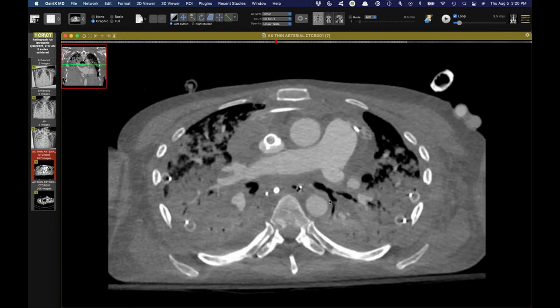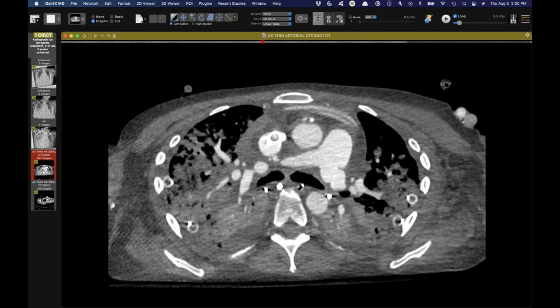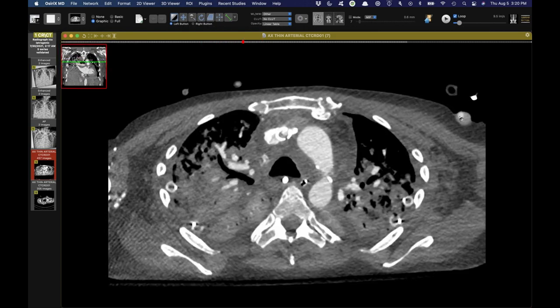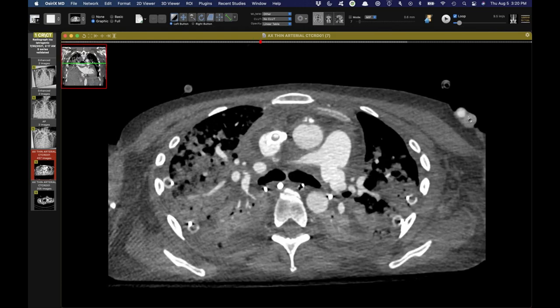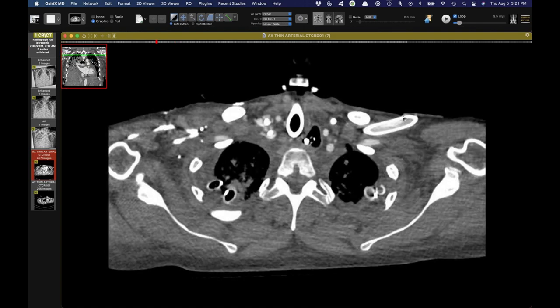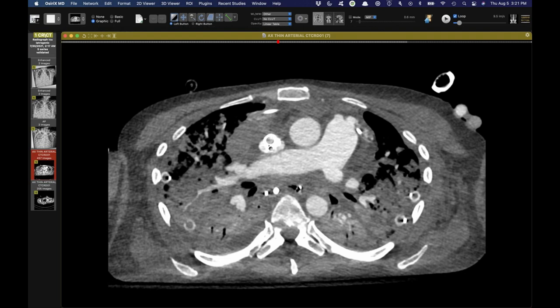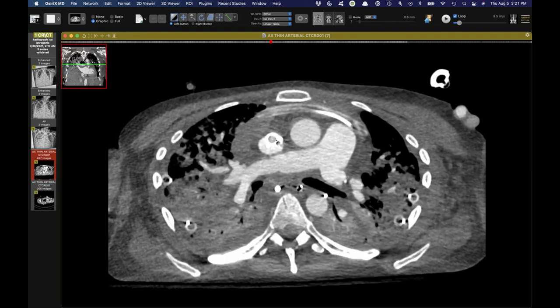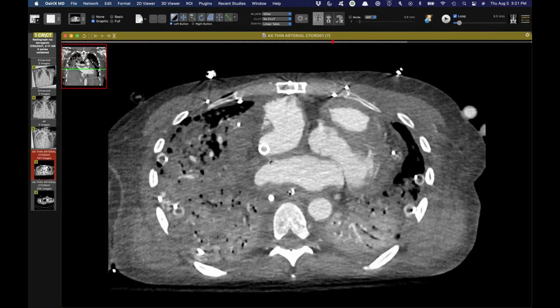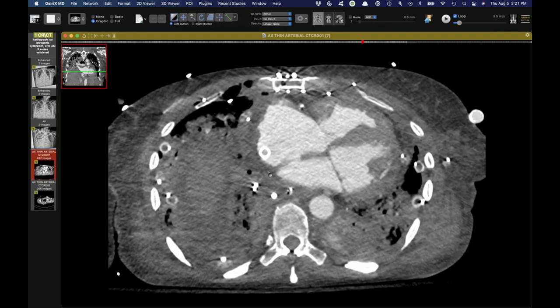Yeah, it is, because actually, Howard, I think you've spent more time studying these than I have, but you can see that in fact it is two channels, because you can see the different lumens right there, and one actually surrounds the other. I was looking at this as I was putting this together, because I noticed that the tip of this, as I scroll towards the superior vena cava, you almost wonder, is there thrombus or something in it? But I think it's just the different levels of opacification, and you have one that's emptying here and one that's emptying more inferiorly.